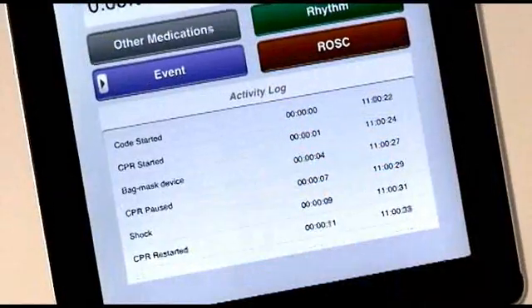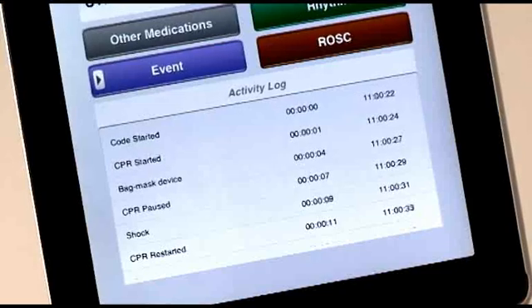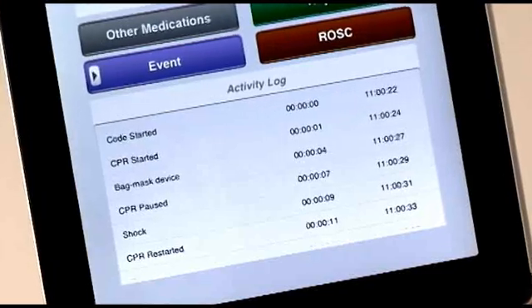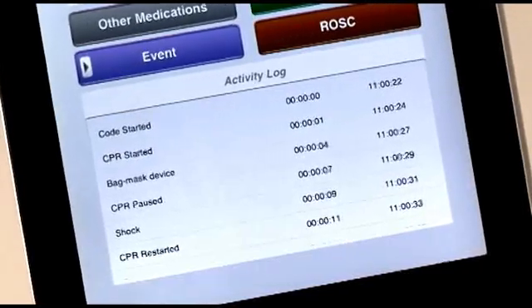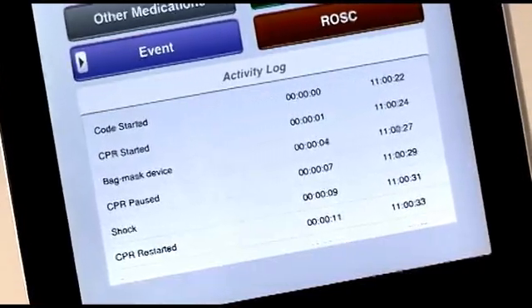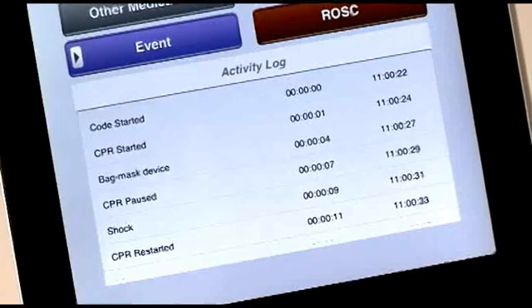The activity log in the bottom half of the app captures the length of the code as well as the activities during the code.